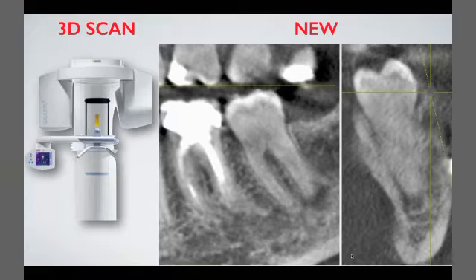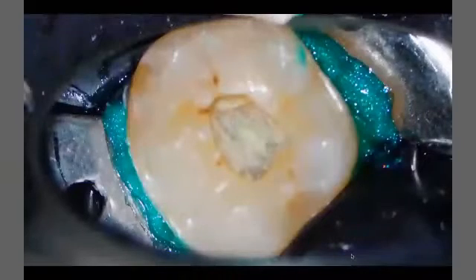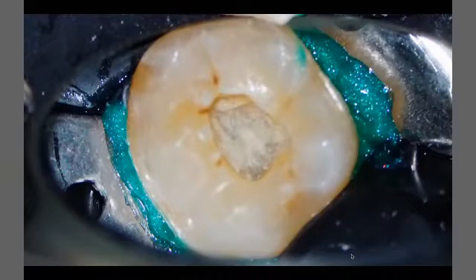But I think because the patient had an accident and has a surgical splint, maybe there was a trauma, and that's why the pulp in this lower molar became necrotic and started causing the problem and the infection for the patient. So we started as usual with our initial outline with the rubber dam.